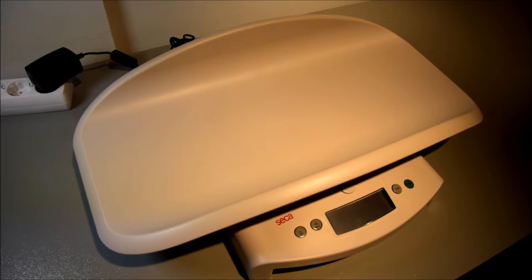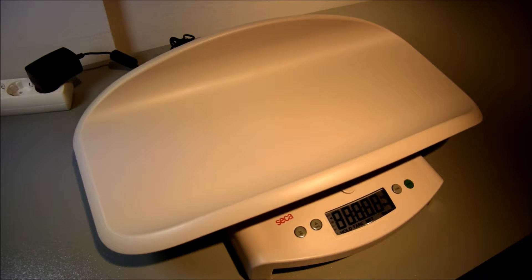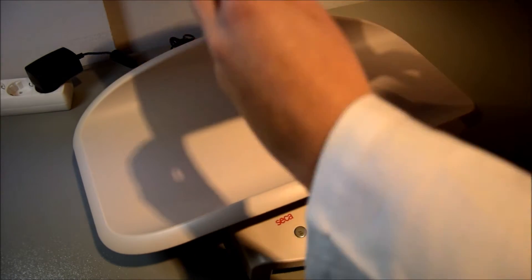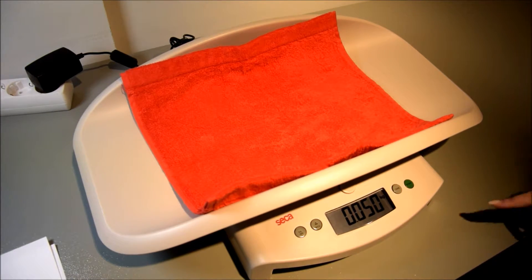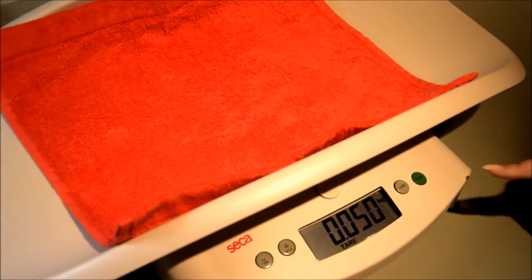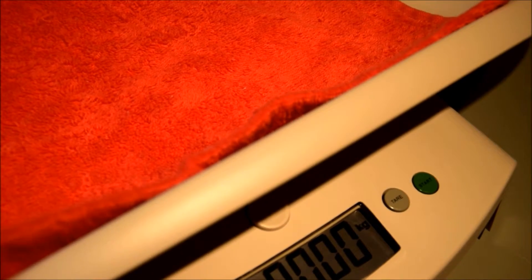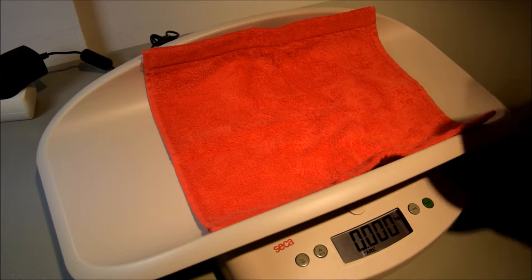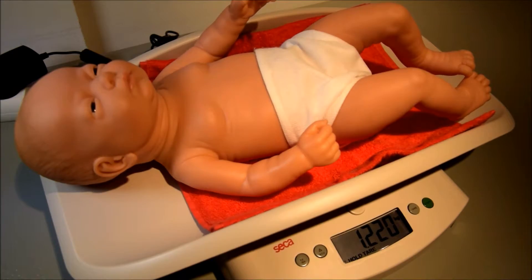Any items which should be excluded from the total weight, such as a towel, can be automatically deducted from the total measured result by pressing the tear button with the towel or other items on the tray. Now place the baby on the scale and read off the correct weight. The additional weight has been automatically deducted and the net weighing result is displayed.